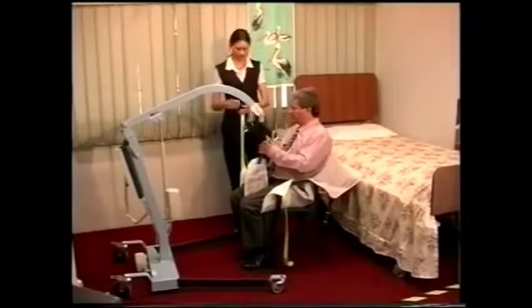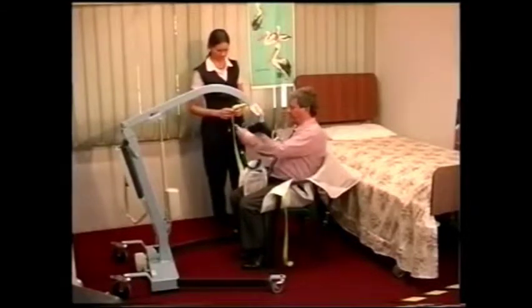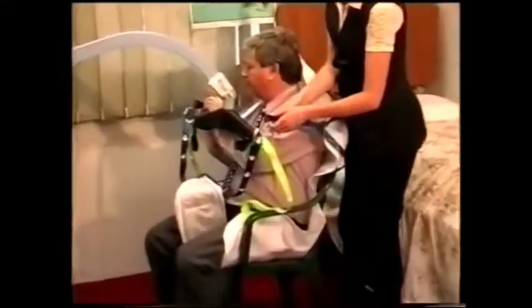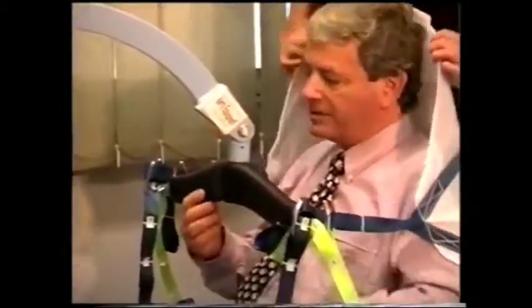Rightio. So look, this time I've put the leg straps. We've got the sling on there. Put it on the middle hook. Try it on the middle hook so I'm not too upright. That'll do fine. Okie dokie.